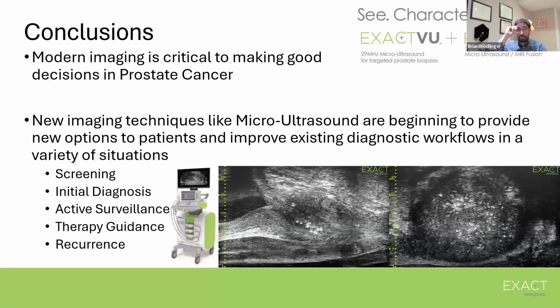Yeah, we've seen a pretty big effect in some places in Canada and Italy in particular. The waiting times for MRIs are very long. At Sunnybrook, it's 6 months for a prostate MRI, you can imagine. Being able to triage everyone coming in, to say I'm doing a scan right away as soon as you come in for a consultation, I see a target, and you're coming back next week for a biopsy, because I've seen something that I need to biopsy, has really made a big difference in a lot of our centers.